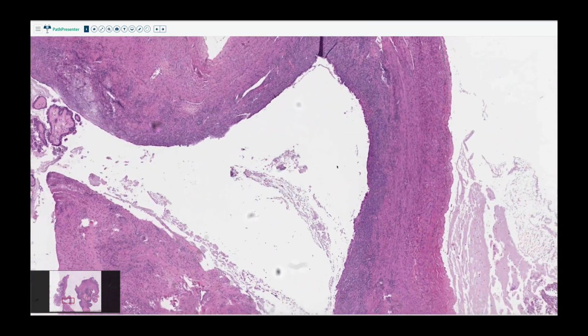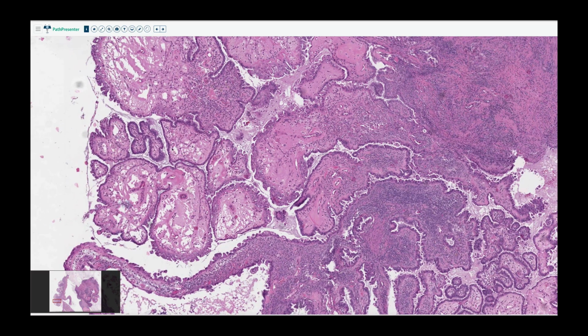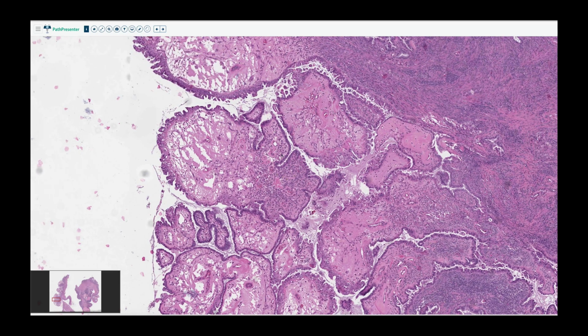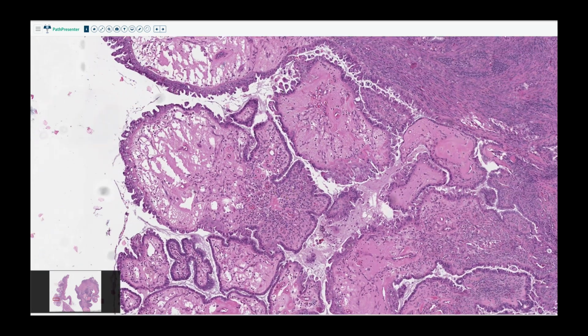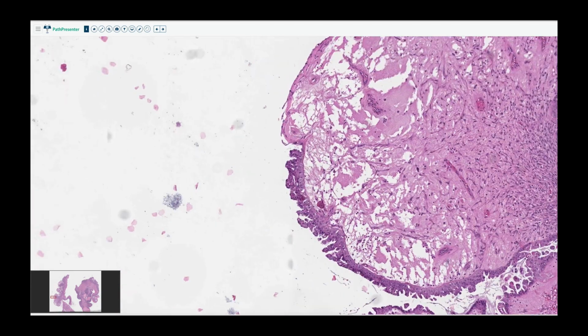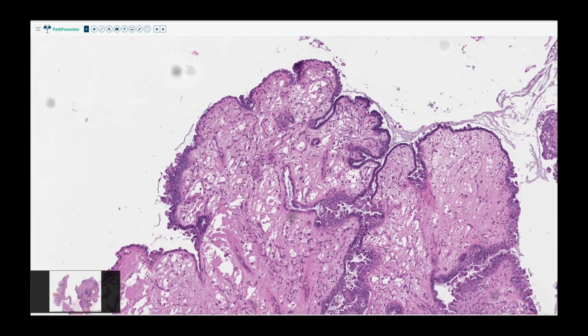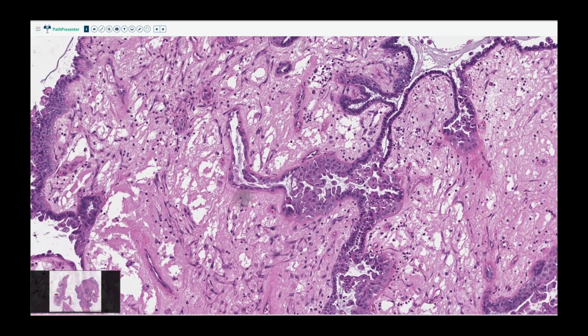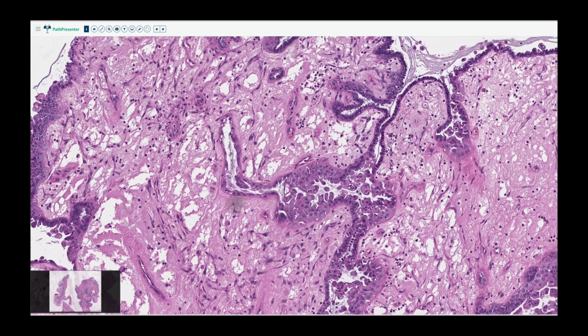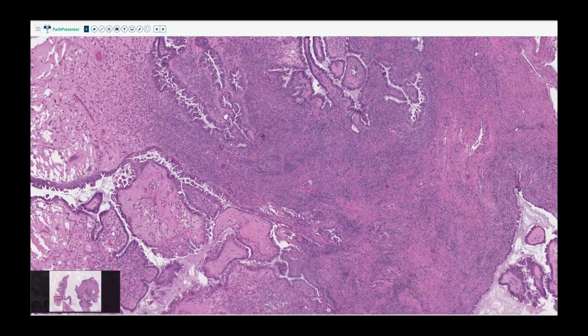Always makes one feel good when you feel like your tumor read the textbook. But nonetheless, this is a seromucinous borderline tumor. It has that nice hierarchical branching pattern, where you get the sense that it starts out big and goes intermediate to small. It does have some of those eosinophilic detached cells that the serous borderline tumor we looked at back at the beginning had as well. And just the same, it has mucinous and serous cells lining the tumor. So this is a seromucinous borderline tumor.